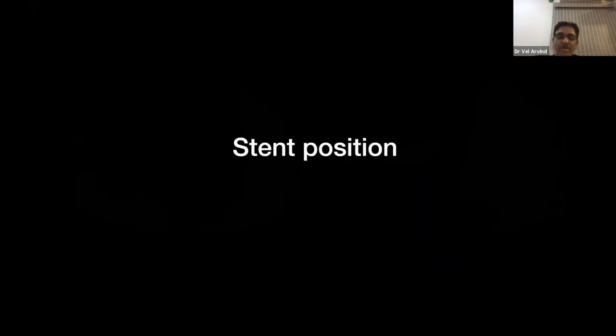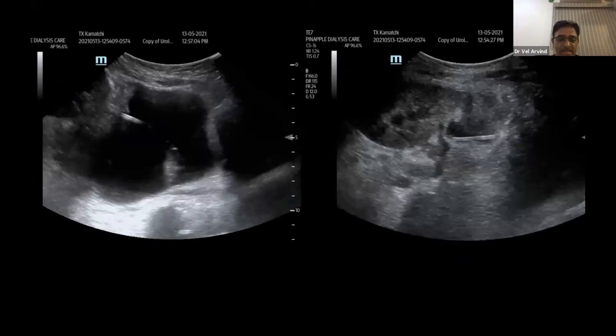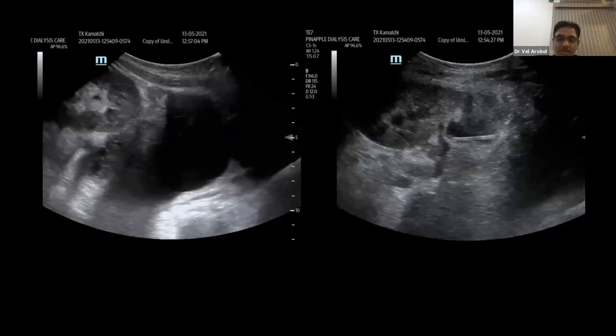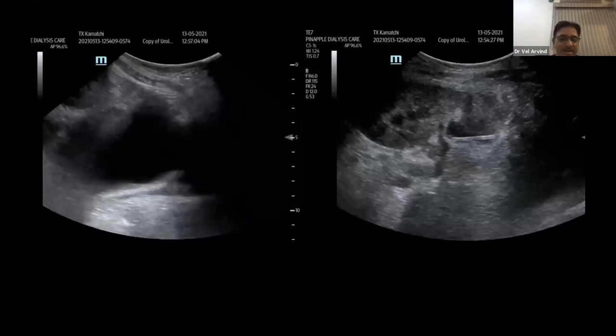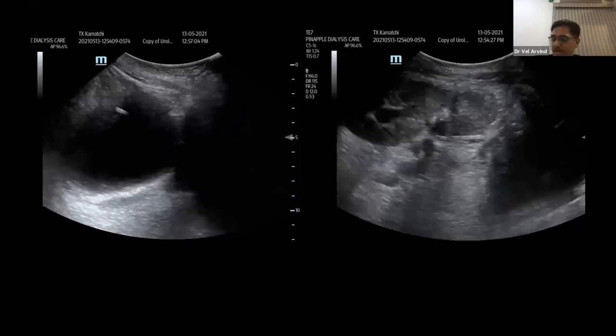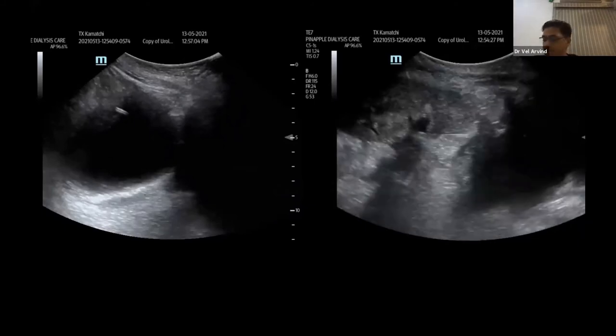The moment the patient is going home, put a probe on and make a documentation that the stent is in the bladder at the graft. So that documentation makes sense at least for the initial 6 months. After that, you can delete all the data because it's not going to help us anyway, except the diagram you are documenting on the initial day of transplant. So this is what it is, see, you can see the stent here. So here you can see the stent here.